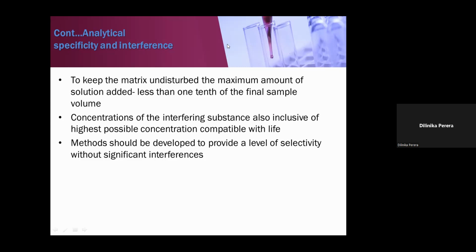And you all know, especially for newer biochemical analyzers, they have hemolysis, lipemia, and icteric indices. If you activate this function, you can see if your sample is hemolyzed, and they will report it as an index. So it is important to find out whether an abnormality in the testing could be due to hemolysis.